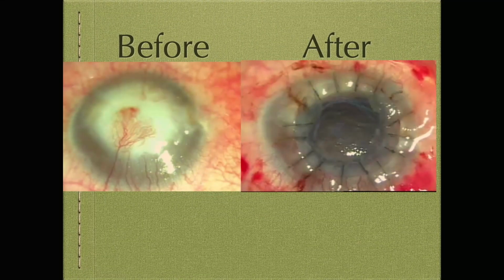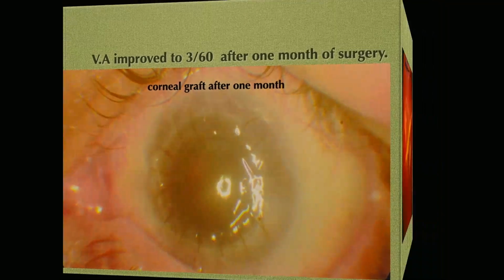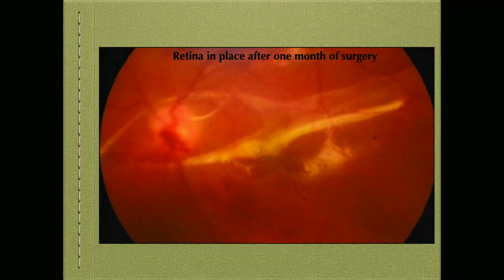This is before and this is after by 2 weeks. Visual acuity improved to 3/60 after 1 month of the surgery, and the corneal graft after 1 month. In this case, I put silicone oil, and I removed the silicone oil after 4 weeks, because if you leave the silicone oil for a much longer period, you may induce corneal problems or decompensation.